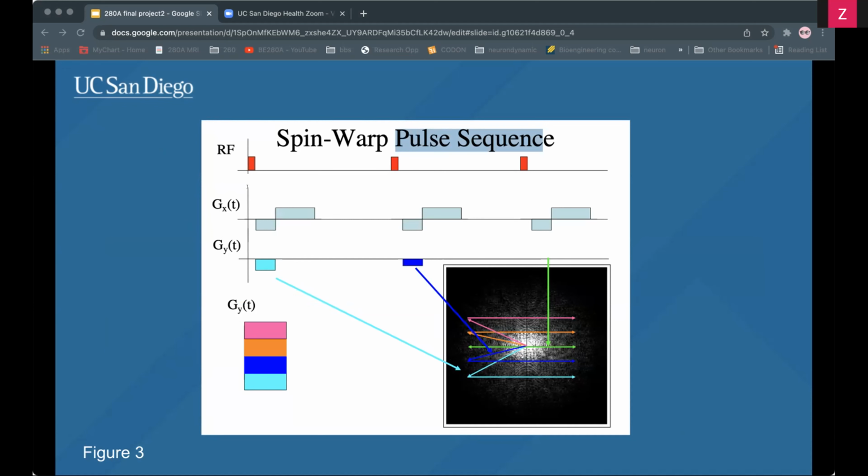So what makes compressed sensing possible in MRI? The freedom to choose the sampling trajectory plays a major role in making compressed sensing possible in MRI. Relating to our course material about the gradient, the trajectory Kx and Ky, these waveforms, along with the associated RF pulse used to produce the magnetization, we call the pulse sequence. The integral of the gradient waveforms traces out the trajectory in the spatial frequency domain, which is K-space, what we've been working with a lot this quarter.